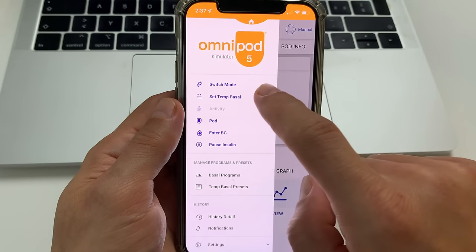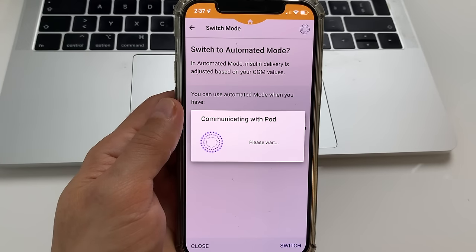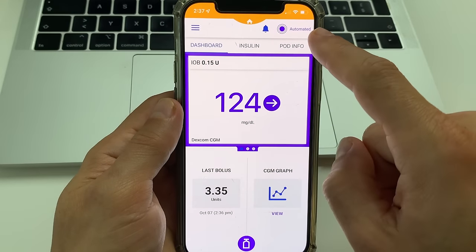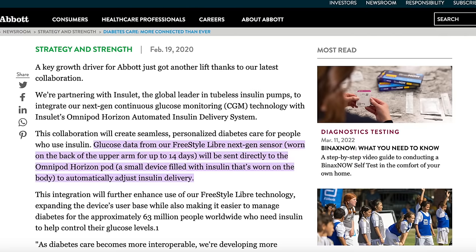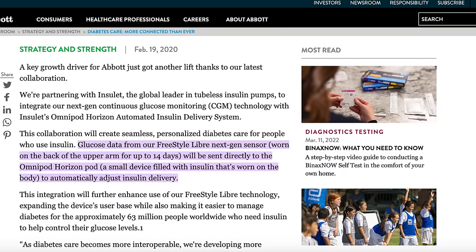To switch to automated mode, you need an active pod and a valid Dexcom G6 transmitter number saved in your Omnipod 5 app on your phone. You can turn the automated mode on and off anytime with just one click in the Omnipod 5 app. Right now Omnipod 5 only works with Dexcom G6, but I believe it will work with Dexcom G7 shortly after its launch, which just happened in some European countries. I also believe that it will work with Freestyle Libre at some point, because the companies behind Omnipod and Freestyle Libre have previously partnered to offer an integrated digital health platform.